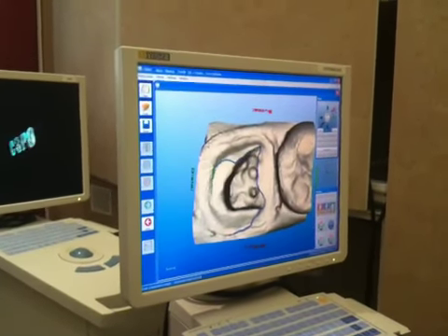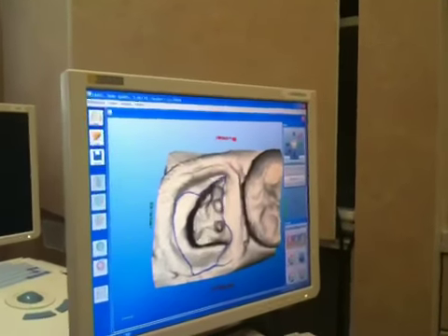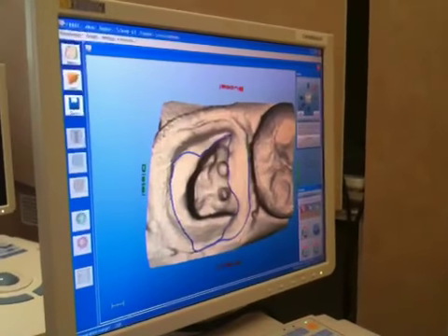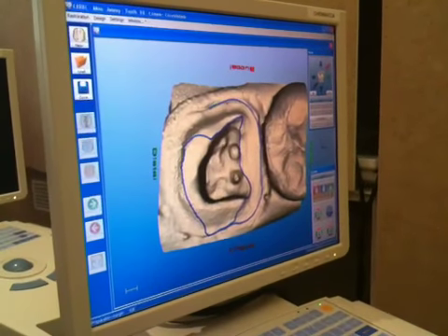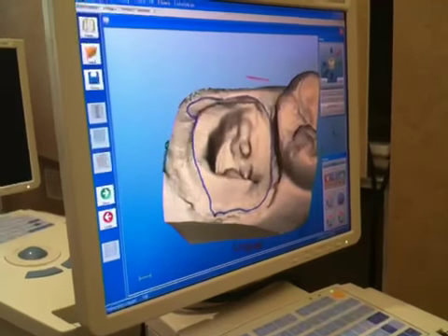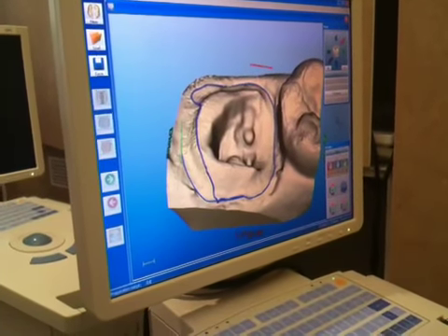I'm quickly going to get the computer out of a manual mode here by drawing a blue line. And now I'm going to go in and we're going to copy where the crown needs to begin. And sometimes this is below the gum tissue when it's needed, and sometimes this is above the gum tissue. And so the computer doesn't care where it needs to go. It just cares that we give it a nice line, and the computer will do the rest for us.